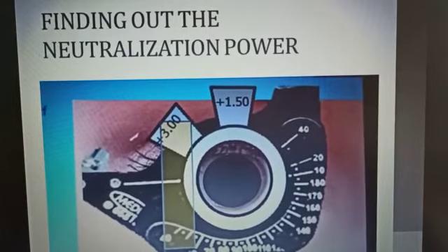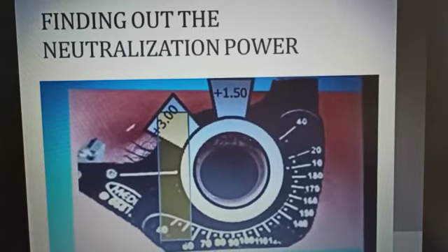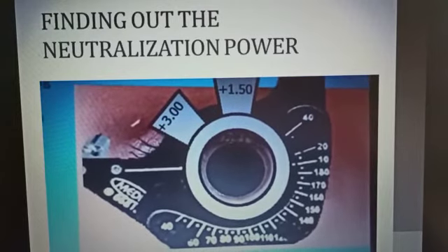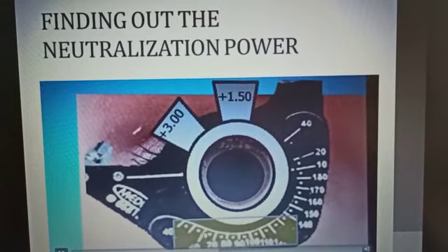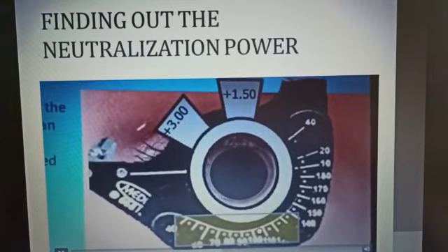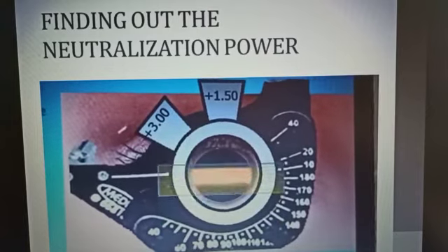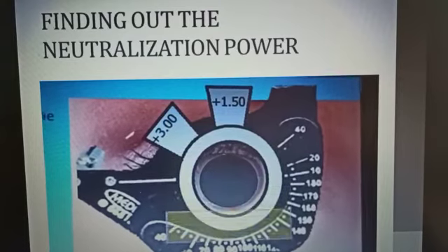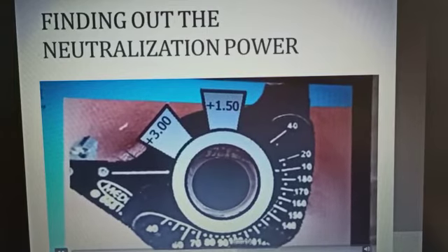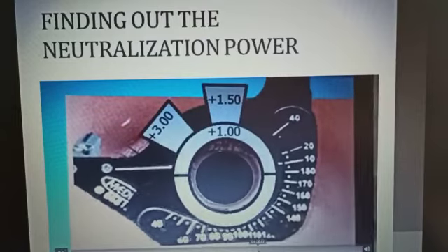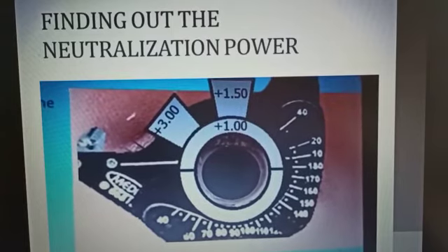Now what you have to do is rotate the rotating sleeve of the retinoscope to rotate the reflex to the horizontal meridian. Now you can see it has been rotated to the horizontal meridian. We have to check the reflex at 180 degrees. Here you can see the reflex is with movement. So now we have to add plus cylindrical lenses. We have used plus 1 cylindrical lenses.